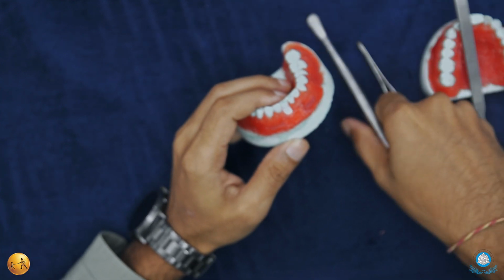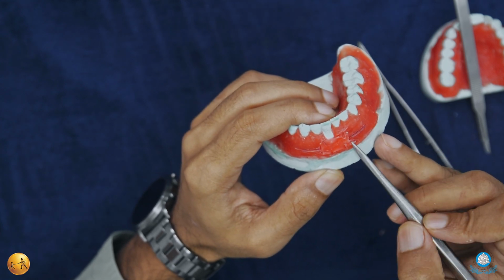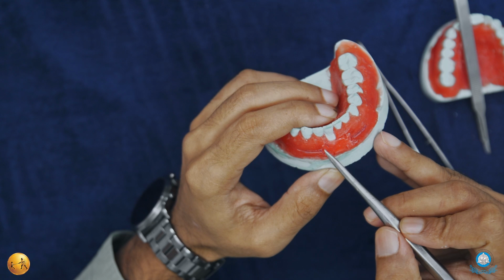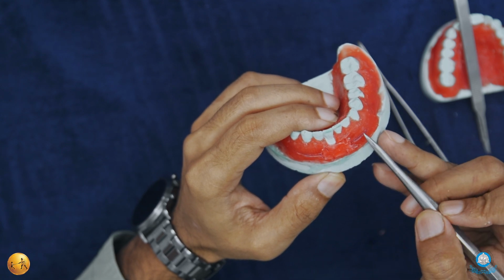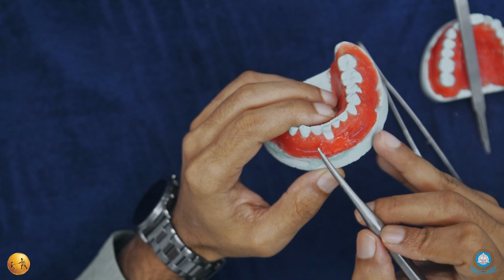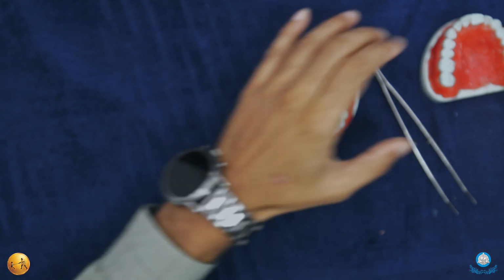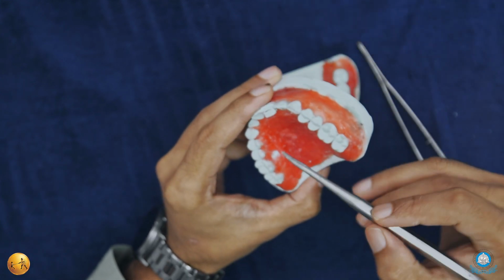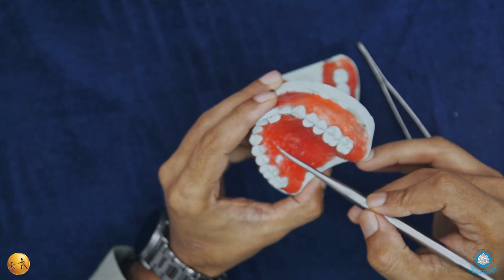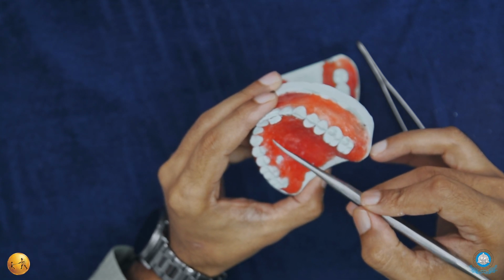So this is going to create a zone of attached gingiva around the teeth which had class 2 recession crossing the mucogingival junction. After you have secured the graft, the last step would be to make sure that you have sutured the donor site with suspending sutures so that the bleeding is controlled.